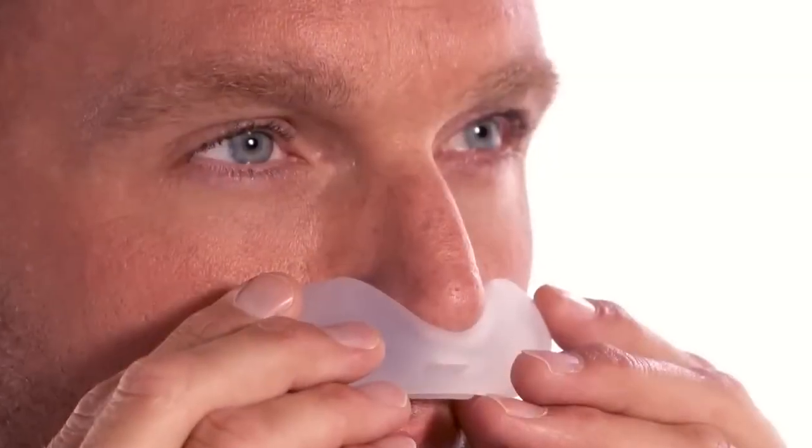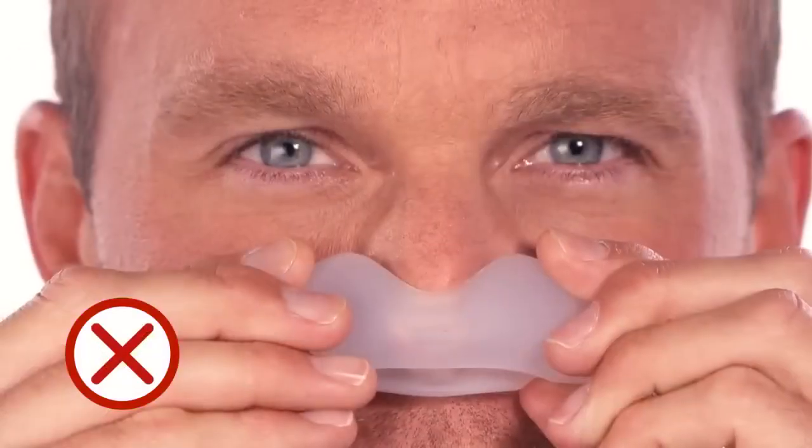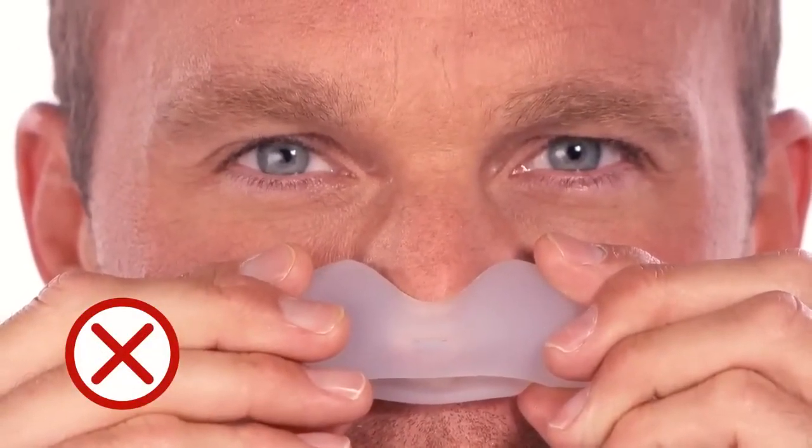To check the cushion size, position the cushion under your nose so that the openings are directly beneath your nostrils. The cushion should rest on the outer edge of your nostrils and the tip of your nose. Your nose should not be inside the cushion opening at any time. If part of the cushion overlaps your nose, the cushion is being worn incorrectly.